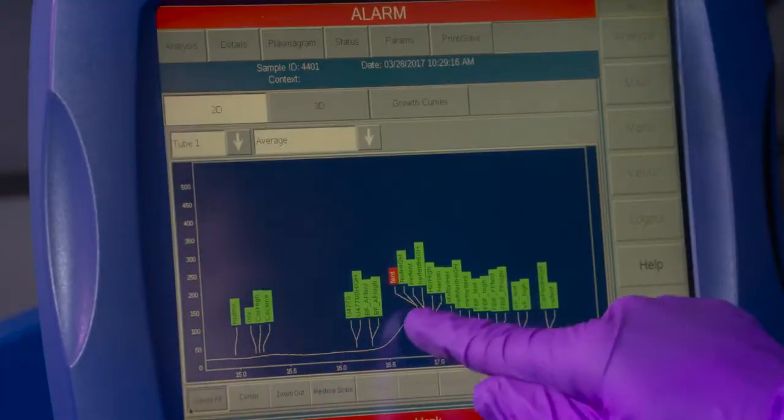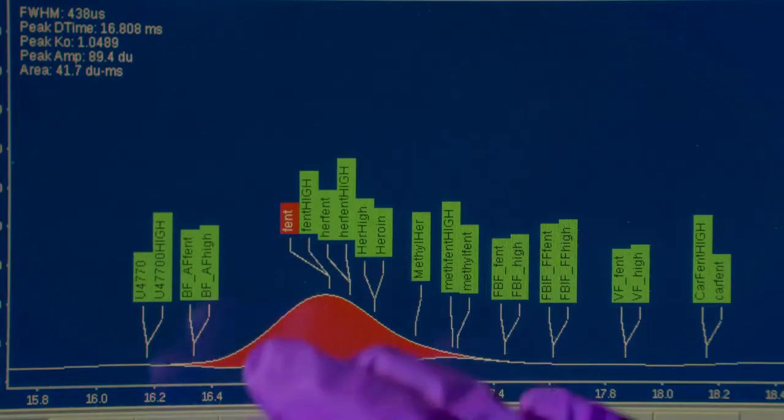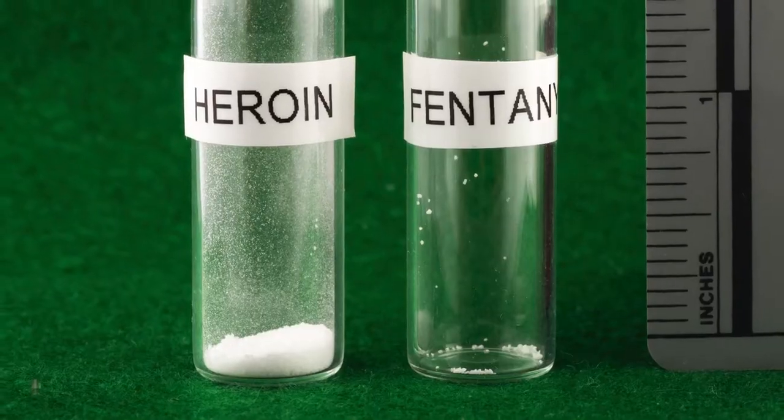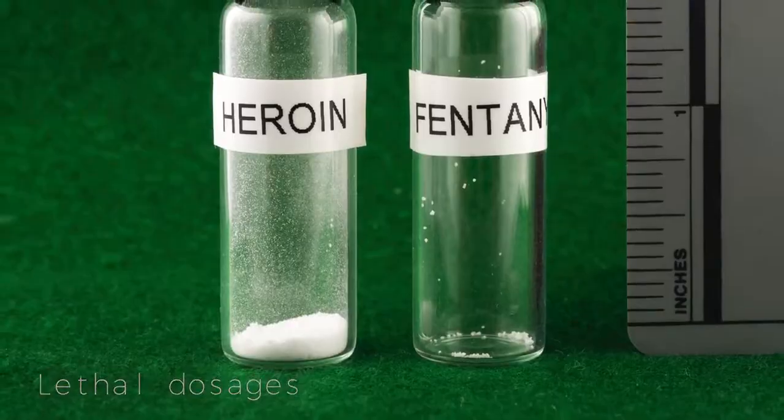on the streets, and we were able to see if this technology can separate those and determine all those different fentanyls. So fentanyl is typically found at a few weight percent with either heroin or a cutting agent or something else. So the question was, even at that low percentage, is it still able to detect these compounds? And we showed that even at 1,000 to 1, we're still able to readily detect the fentanyl signal.